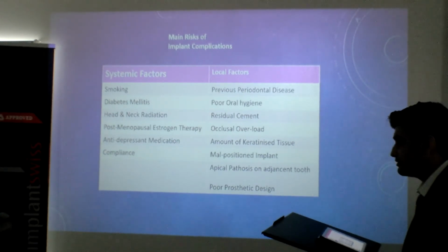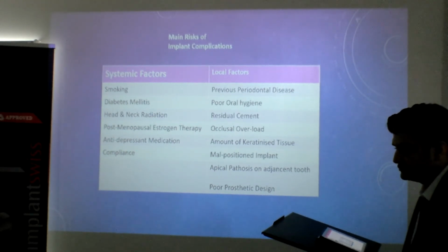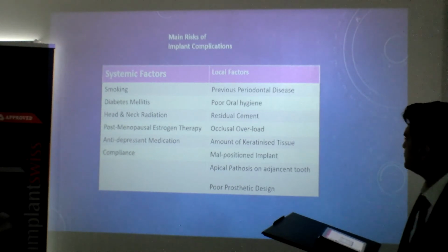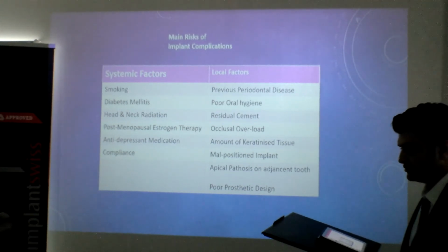Main risks of implant complications: if it is wrongly placed, of course that's one issue, we know that. But if it is in the bone and wrongly placed, what issues will you face? First in terms of restoration, and then in the follow-ups. For restoration, nowadays you can rely on angled abutments, multi-unit abutments. But the shape of the restoration would be affected in some cases, and the cleansability of the crowns, because in the right line, it can just be like a normal tooth, unlike if it's too far back or forward.